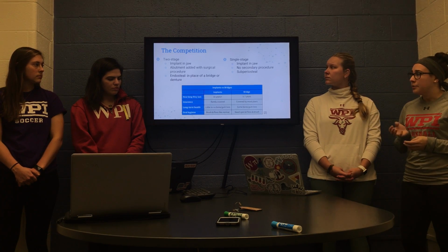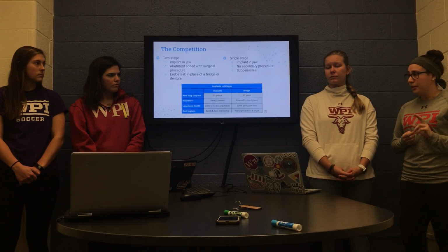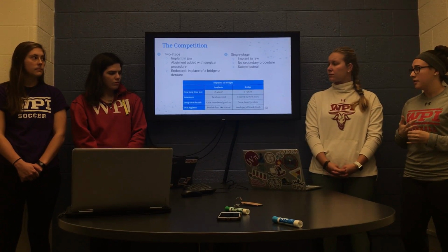And then for implants and bridges, implants are much longer lasting, and they lead to little to no bone or gum loss, which is significantly better than the bridges where there can be bone and gum loss.